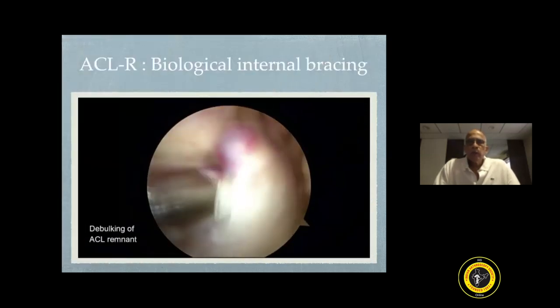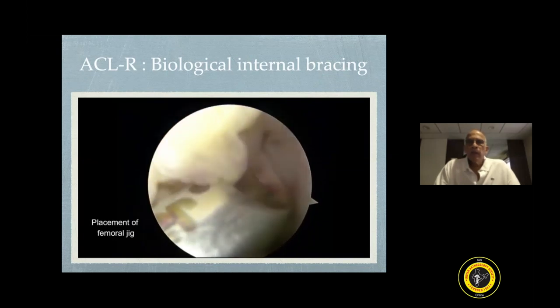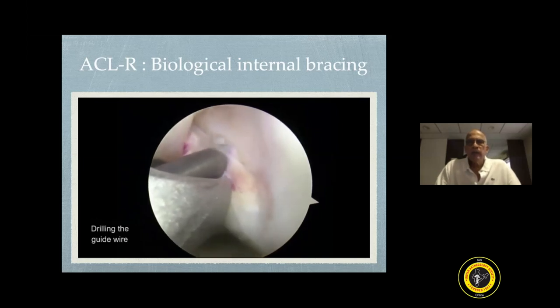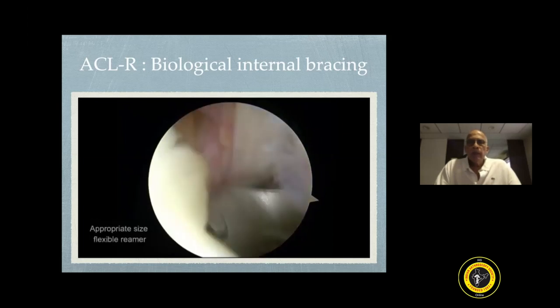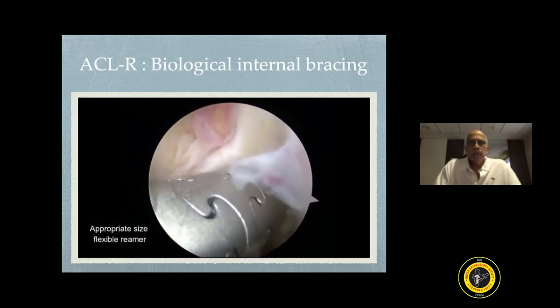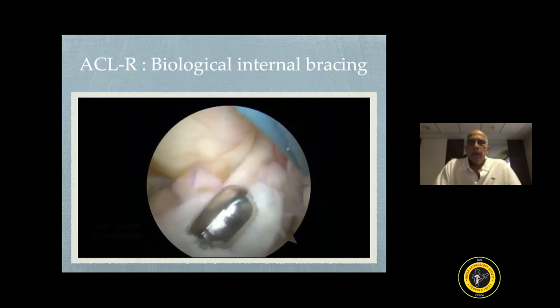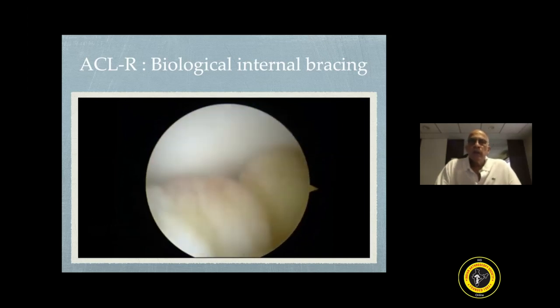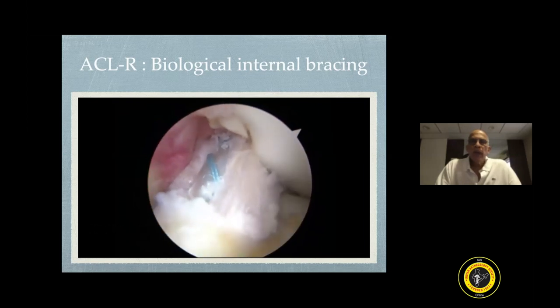This is a video which shows how you can do biological internal bracing or a completely biologic ACL reconstruction. A flexible reamer is being used here to identify and drill the femoral tunnel — you can see that a majority of the soft tissue has been preserved. Once the femoral tunnel has been drilled with the appropriate size drill, the tibial tunnel is then drilled at the tibial footprint. The loop is retrieved from the tibial footprint and the graft is passed. This is the final appearance, which shows that the fat pad has been preserved and the ACL graft is at the right anatomic site.